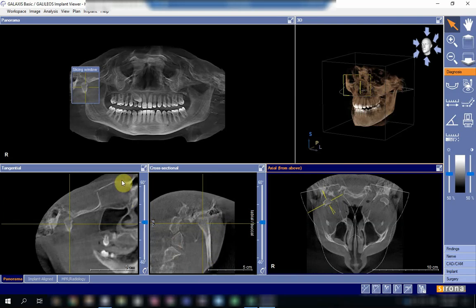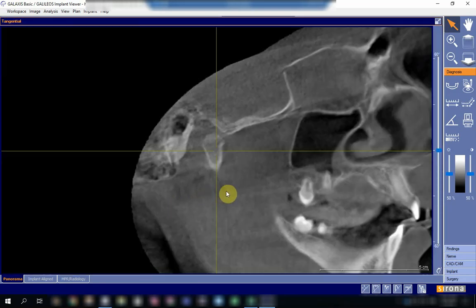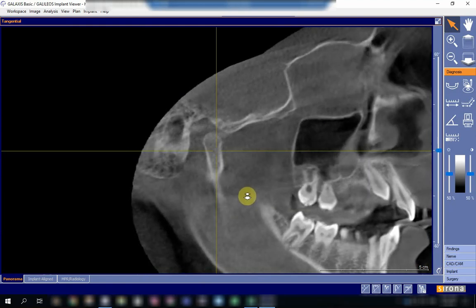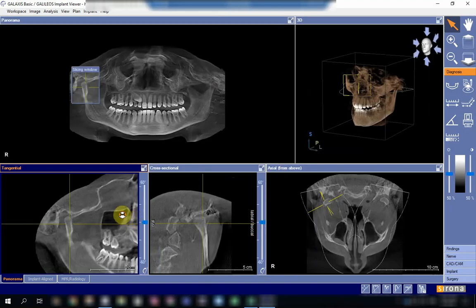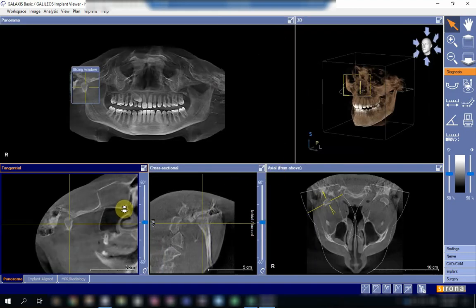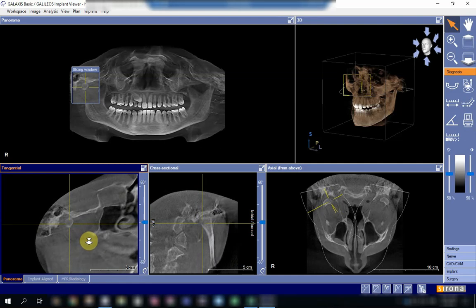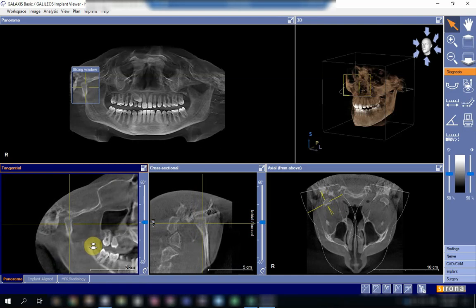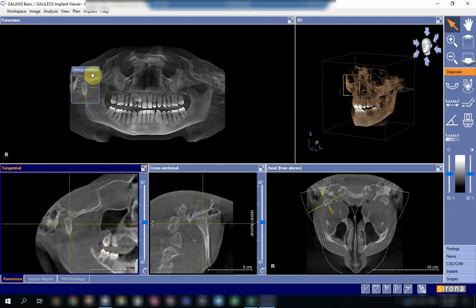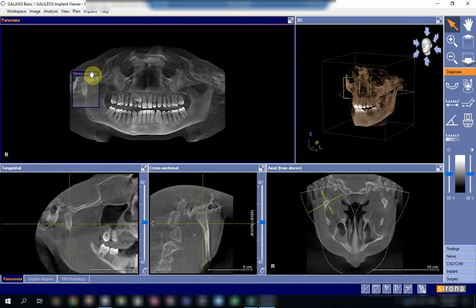If you want to interpret a structure, you will start going image by image, slice by slice. As you can see here, we will try to move the slices and navigate the whole thickness of the condyle from a medial to a lateral view. If we find that everything is within normal appearance, then we will try to have another look at another place.